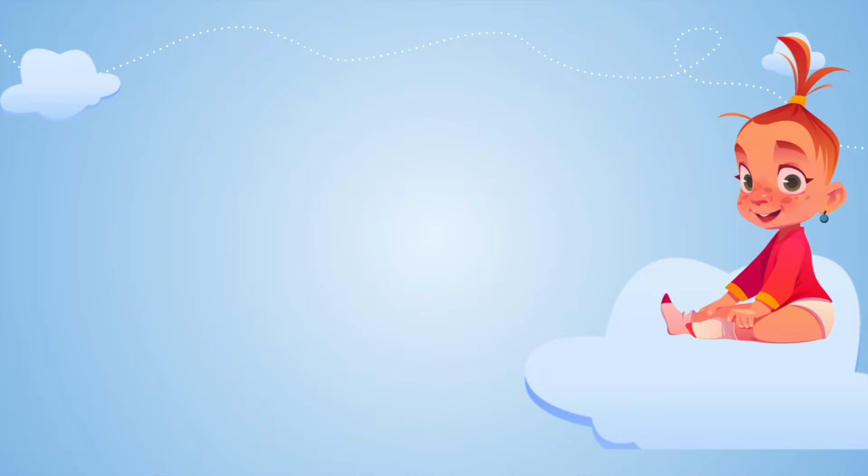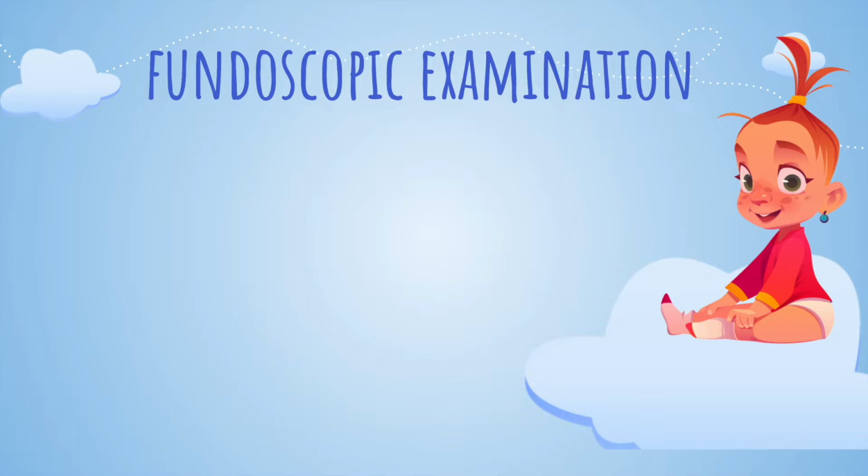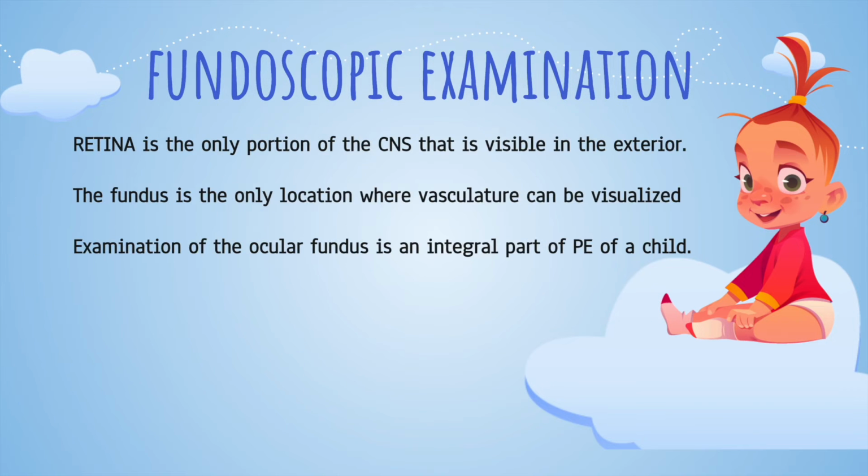First, let's talk about fundoscopic examination. The retina is the only portion of the CNS that is visible from the exterior. The fundus is the only location where vasculature can be visualized, and examination of the ocular fundus is an integral part of the physical examination of a child.